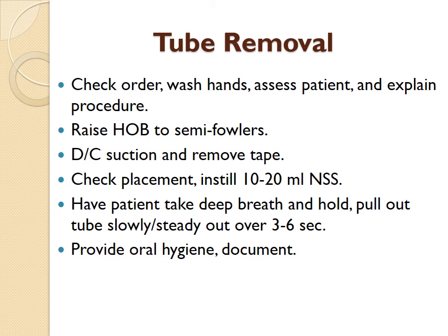Once you do that, if it is scheduled to be connected to suction, you can connect it to suction per the facility's policy. If you brought in what's called a Lopez valve, which is a three-way stopcock valve, and I will show them to you in lab, that usually can be connected to the end of that clear port, which then allows you to not have to constantly be maneuvering the tube itself.